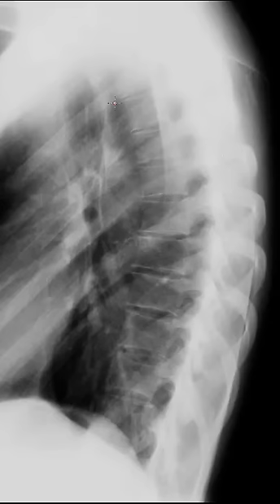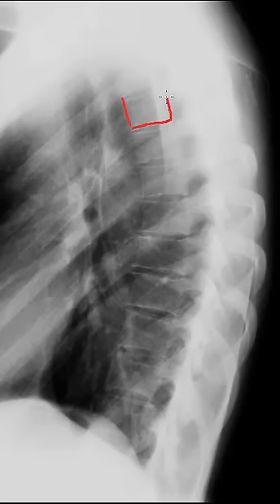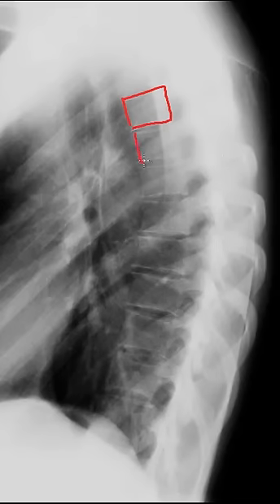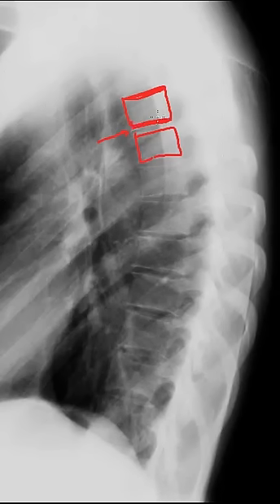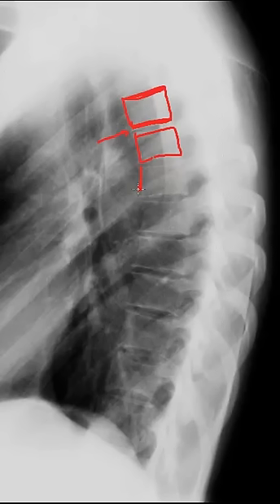Let's start by identifying vertebral bodies again. Now the upper portion of the thoracic spine is notoriously hard to see due to the superimposition of the shoulders with the spine. This is the first well-visualized vertebral segment — we'll outline this one. This is the vertebral body. Here's another vertebral body and of course the intervening intervertebral disc space. Remember that each vertebral segment has a superior end plate as well as an inferior end plate to which the intervertebral discs attach. Here's the anterior margin of the vertebral body, which can look sometimes concave, specifically in this region as we begin to see degenerative changes.